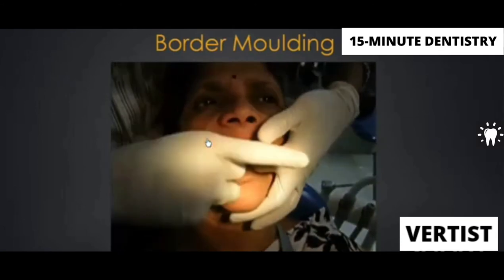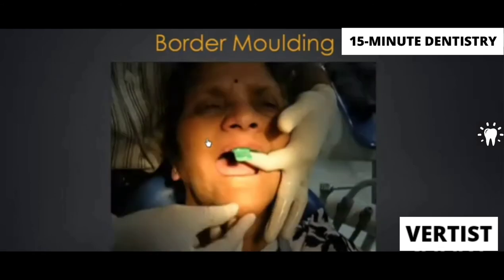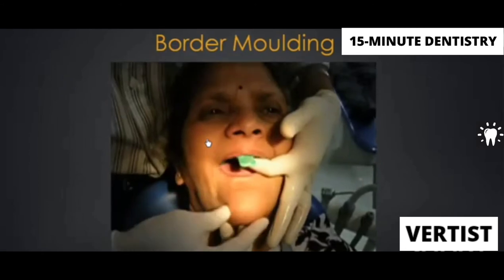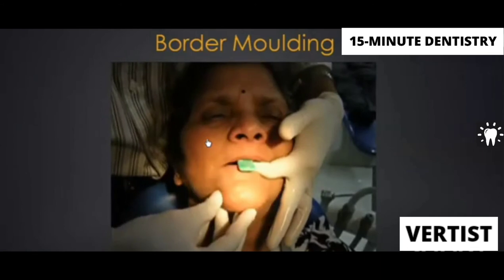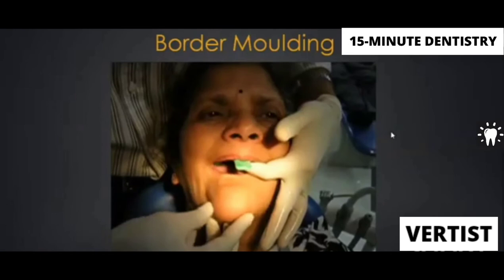So for that, what we do is we place the tray in the patient's mouth with the soft material, ask the patient to close the mandible a little, and then do side to side movements. Okay, the mandible is supposed to move side to side. So just ask the patient to close a little and then do side to side movements. I hope all of you will remember this.